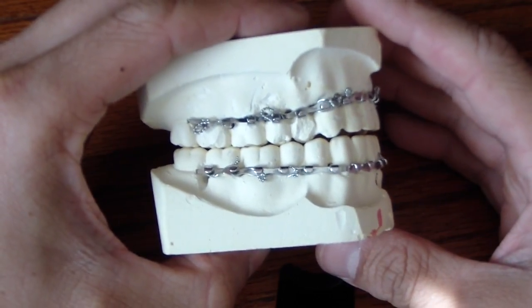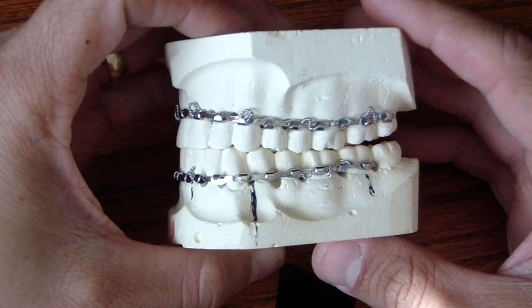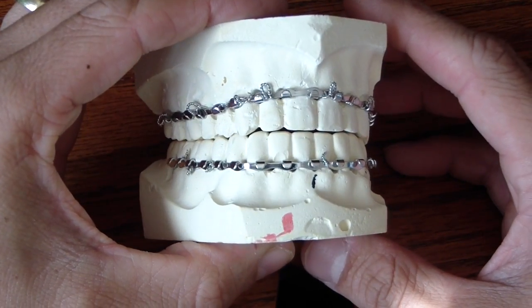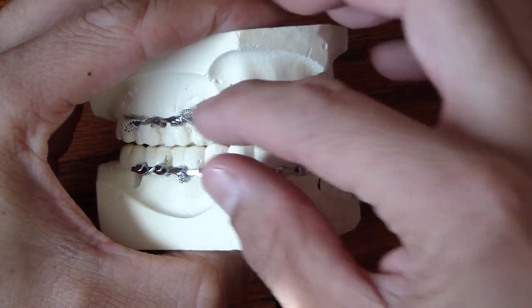Hey folks, I'm Ashley from AllThingsIndustry.com and what I wanted to show you today was maxillomandibular fixation, MMF or IMF intermaxillary fixation with Erich arch bars. We're going to be using Erich arch bars.